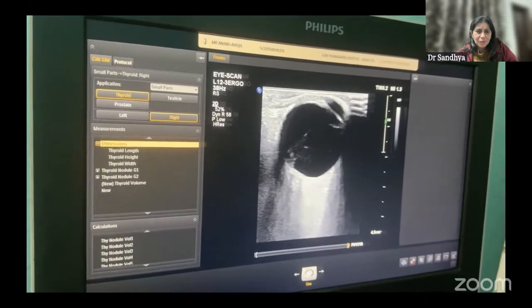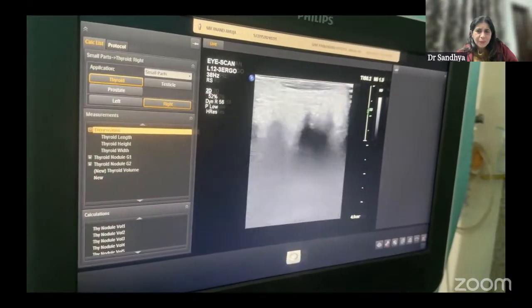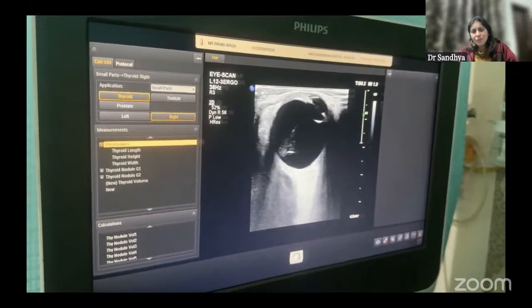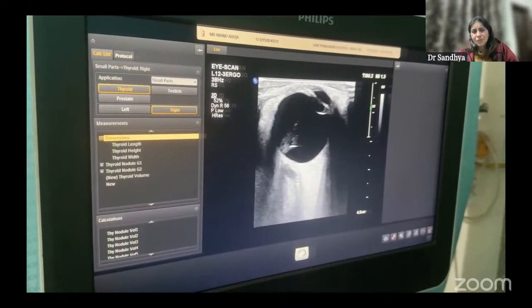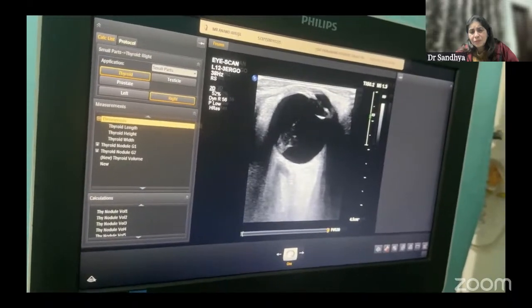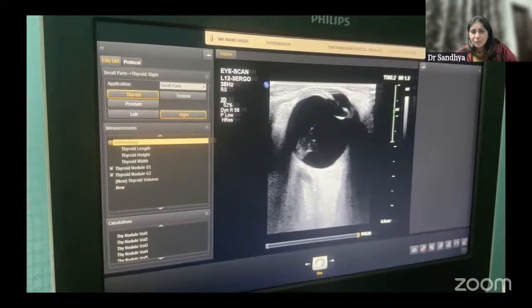Take a printout of this screenshot. Unfreeze. You see these membranous fronts which are attached to the retina are now clearly visible. We take a printout.